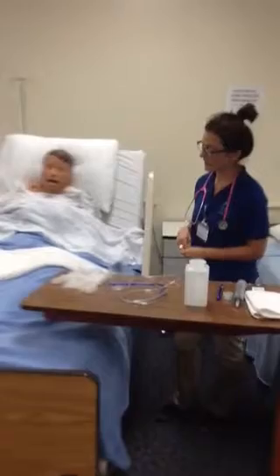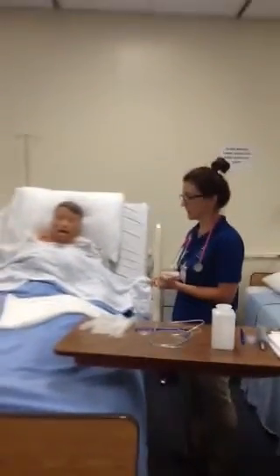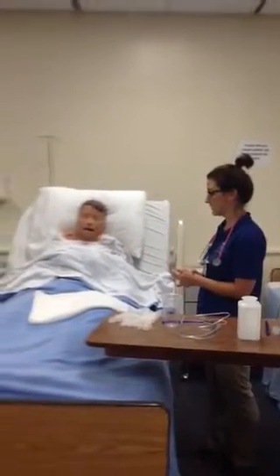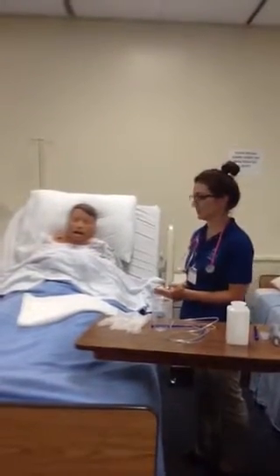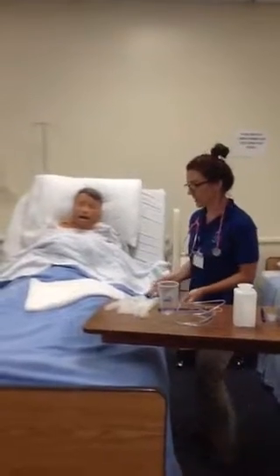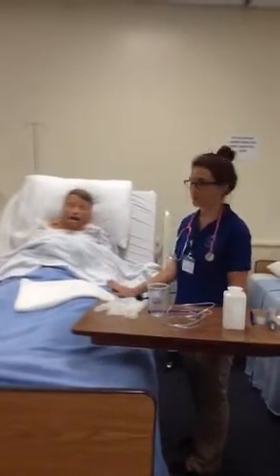Hello. Hi, I'm Kristen Collins. I'm going to be your nurse today. Your physician has ordered us to place an NG tube to help get some of those gastric secretions out of your stomach. Can you tell me your name? Mitchell Wilson. All right, Mr. Wilson, what's your date of birth? 7/27/54. Okay, Mr. Wilson. I would verify that against his wristband, just for safety precautions.